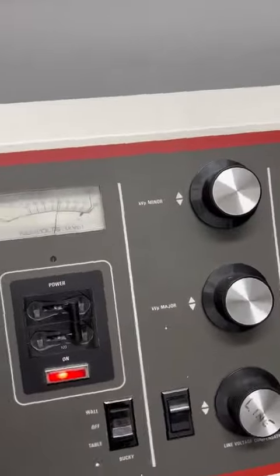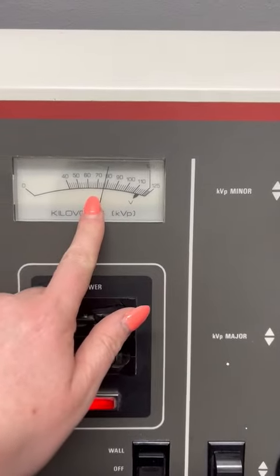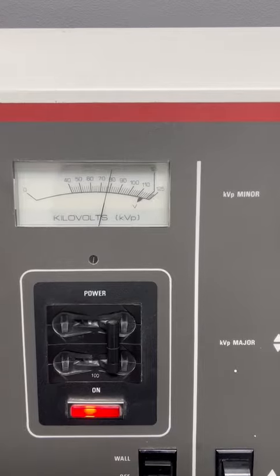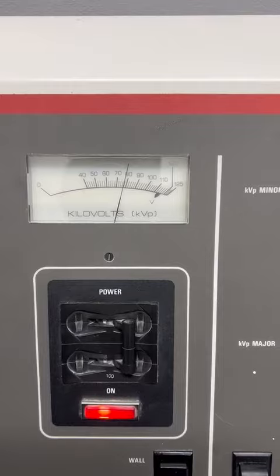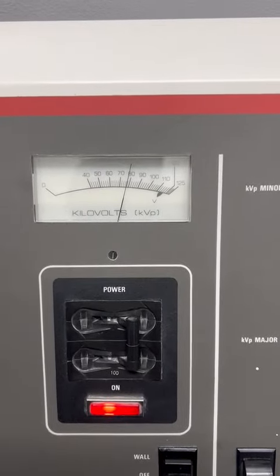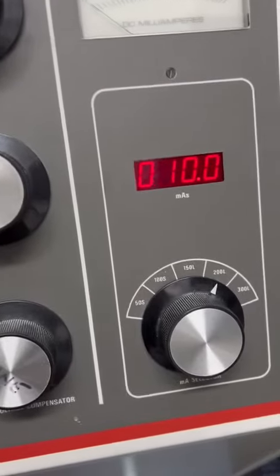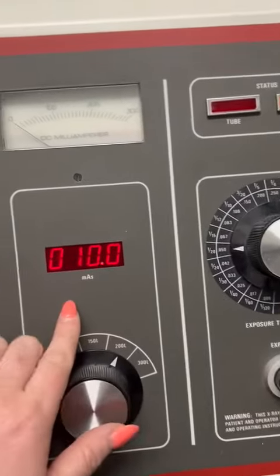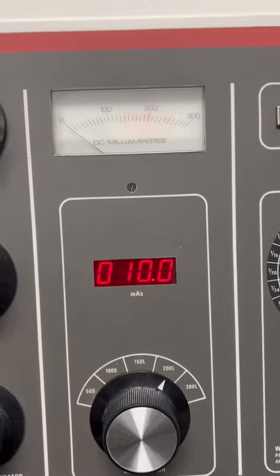Come on to the back. Back here we have it set on about 80, so anywhere from 60 to 80 is going to be good for a kid. Obviously the smaller a baby, the lower you want to go, or larger the child up to like 18, and then you want to increase the kVp and your MAS. MAS is comprised of MA and your seconds, which gives you MAS.